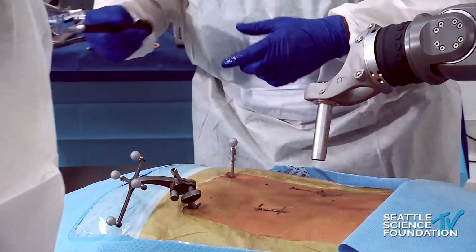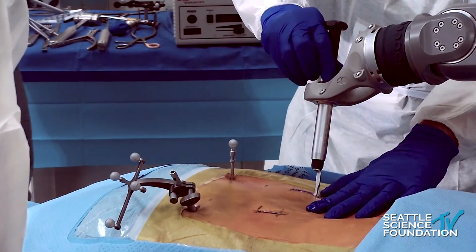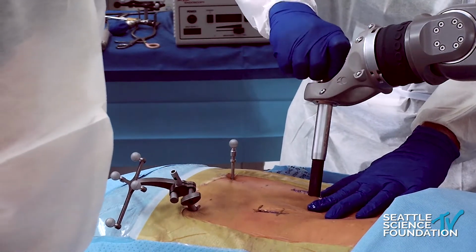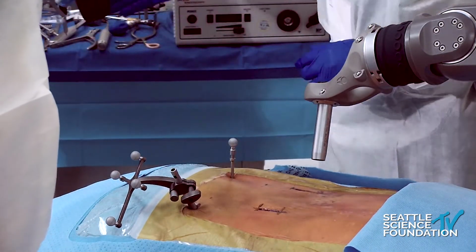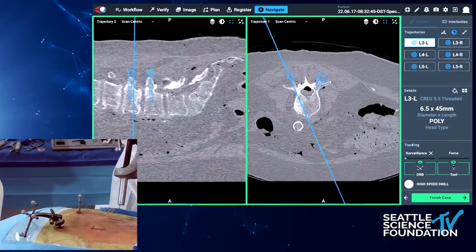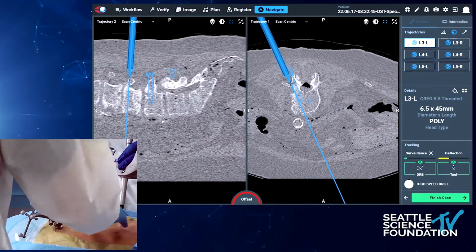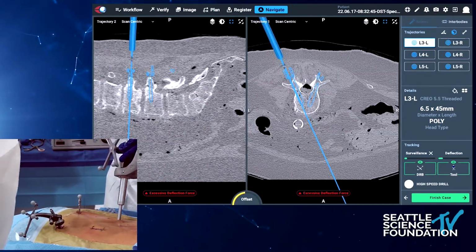So here we go. So long knife down onto the bony elements. Typically, there may be a small bleeder here at this point. I'll take a high-speed burr. So again, this is the tracker for it. I typically come down, thanks, onto the bone. You can see that there. Occasionally, I may need to do a slight micro adjustment.